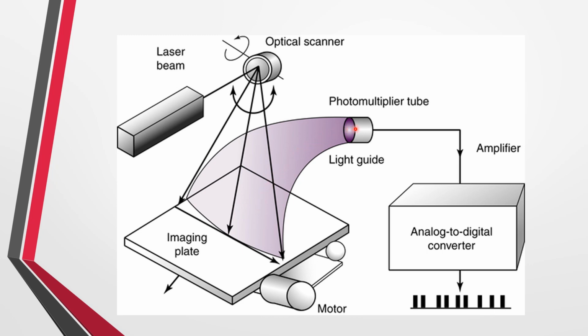That's going to be directed at the photomultiplier tube, and here there's going to be a filter also. So this light is typically very red, the laser. This light's typically very blue. The laser light is monochromatic. The stimulated light is polychromatic, many different shades, which is good because that's going to make up more information for the image.